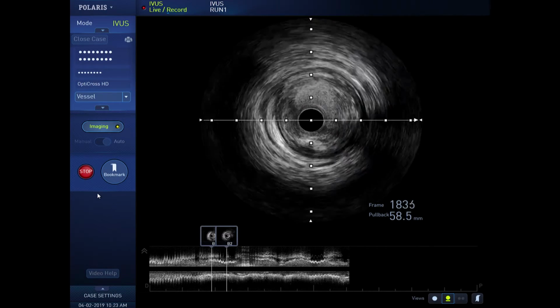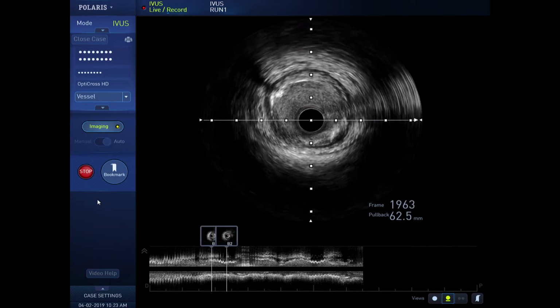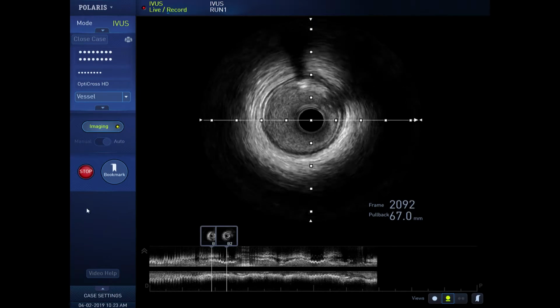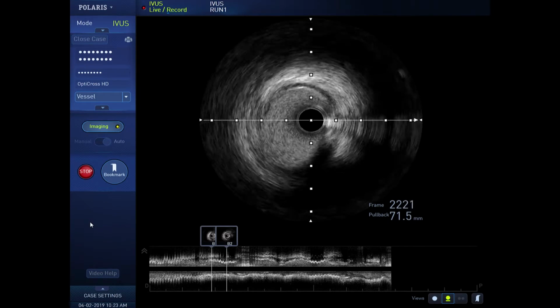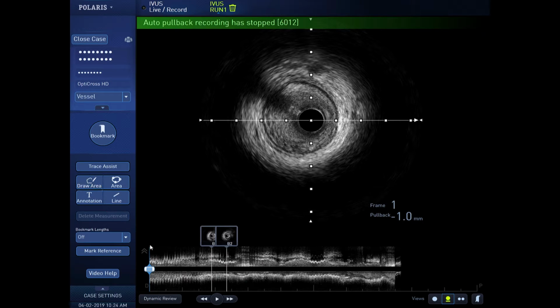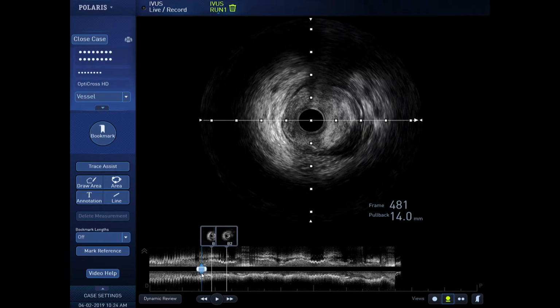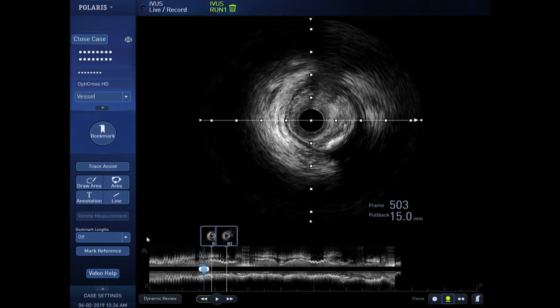They're pulling back inside the artery, going from distal all the way up to the proximal. And what you're seeing here on the screen is the right coronary artery that we just saw. The angiogram is a two-dimensional figure, whereas intravascular ultrasound gives you a great way of measuring the vessel size, the lesion length, and understanding the plaque burden. Are there any comments from Dimmer and Gennaro?